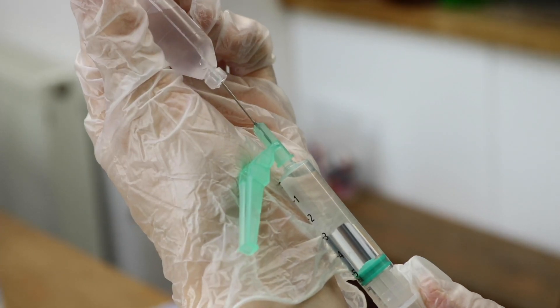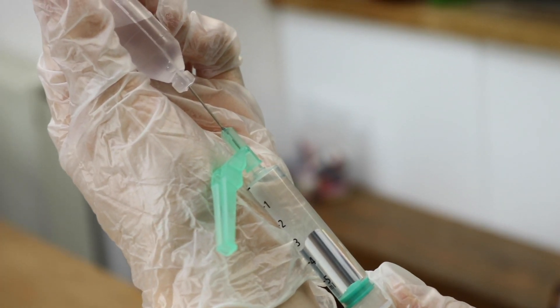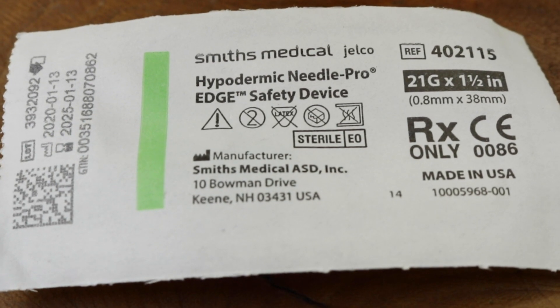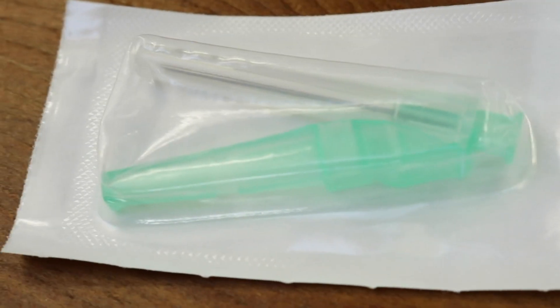Next, choose the right needle. The needle gauge will be between 19 and 25, and the length will be 1 to 1.5 inches, although you might need to use a longer needle — up to 3 inches — in obese patients. The 21 gauge needle, the green needle, would be the one you'd use for most patients.